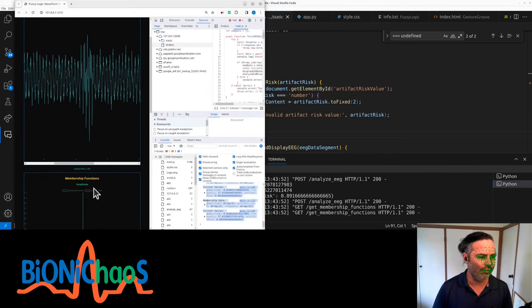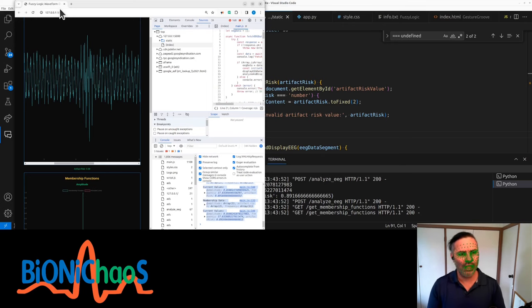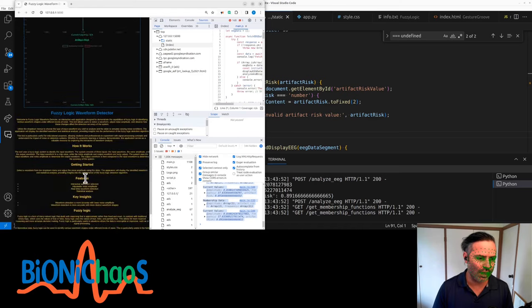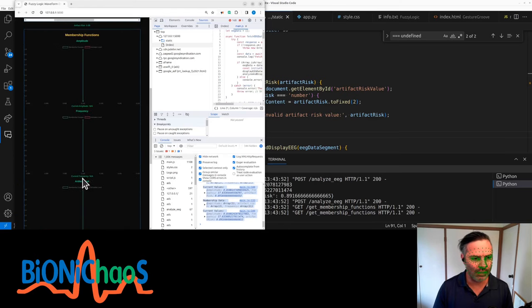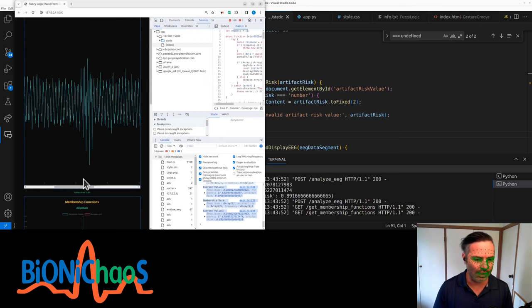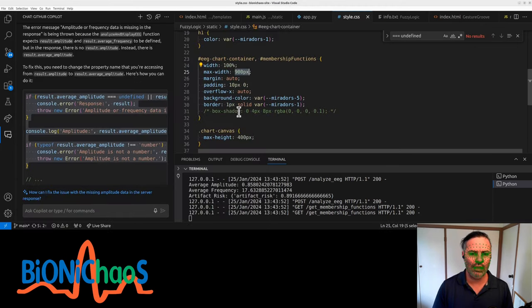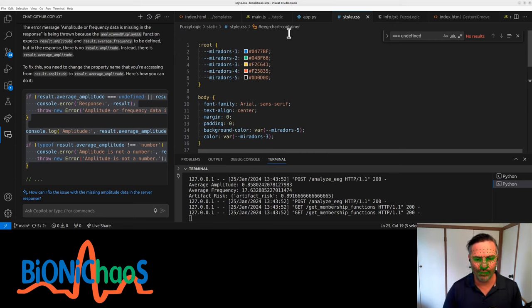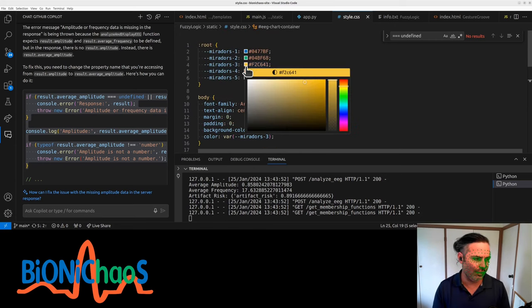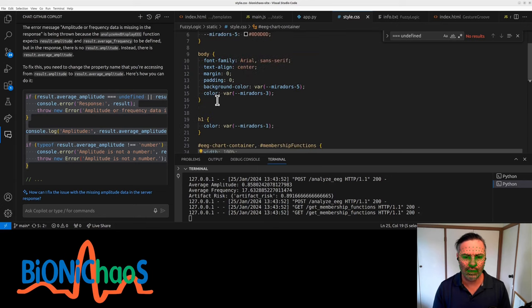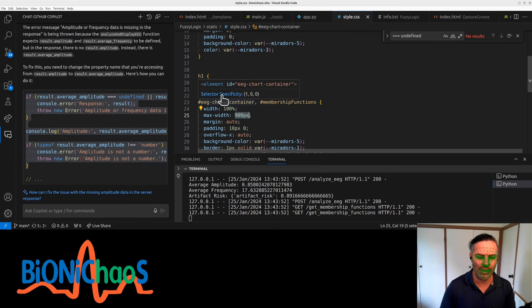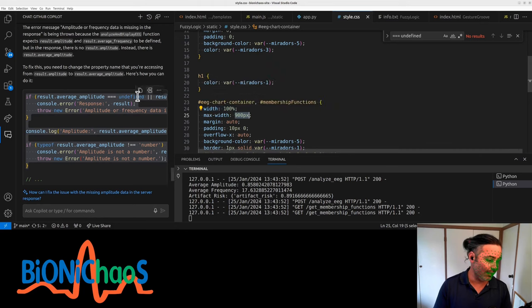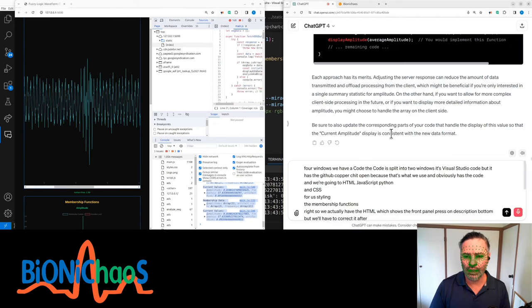The membership functions. Right. So we actually have the HTML which shows the front panel. There's some description at the bottom, but we'll have to correct it after making the more recent changes. I don't know what's up with this. So we have this color scheme that we're using for the project. It's these colors here. They're from some festival in South America. Let's jump into it.